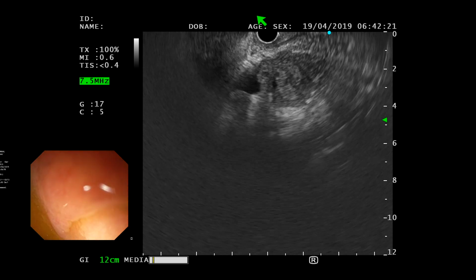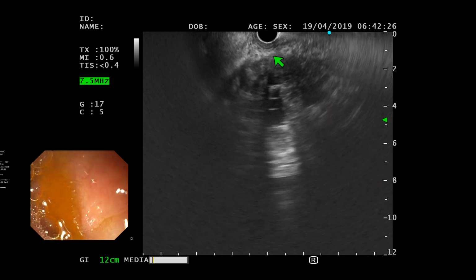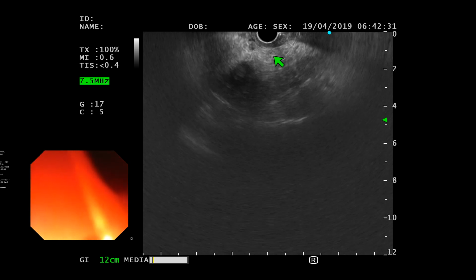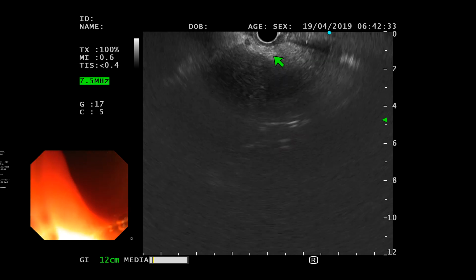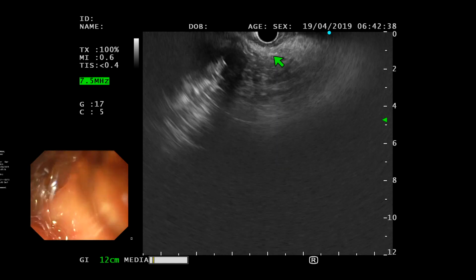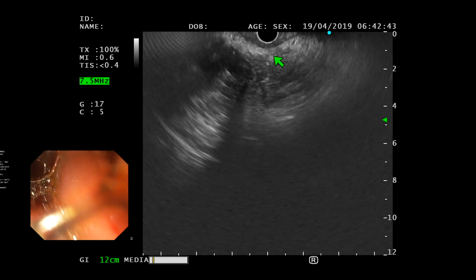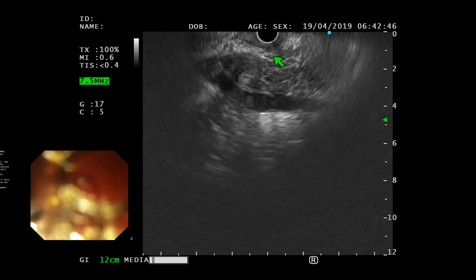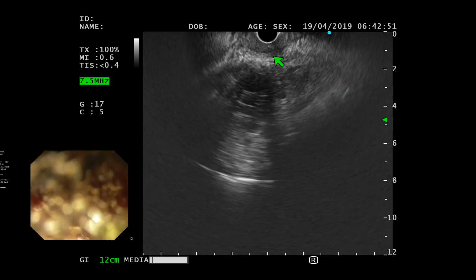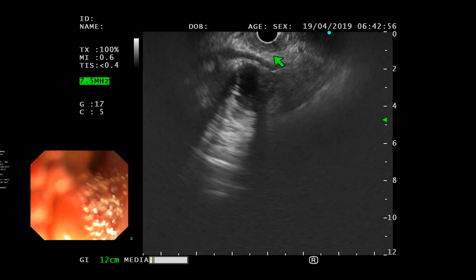One can clearly see that there's an abnormal area here, and we have multiple lymph nodes in the paraaortic region at the celiac region. These are rounded, clearly abnormal. You asked an interesting question because our radiologist in the room was suggesting that those nodes may be benign. Those rounded lymph nodes? Yes. Can you show us the lymph nodes again? Maybe we can come back to that. Okay, we can come back to that.